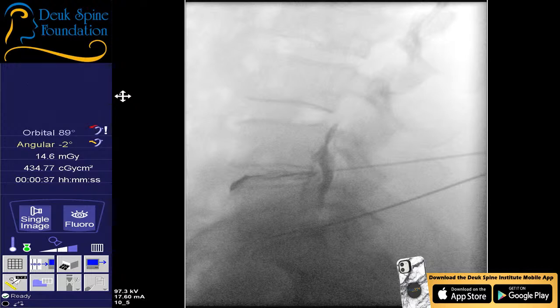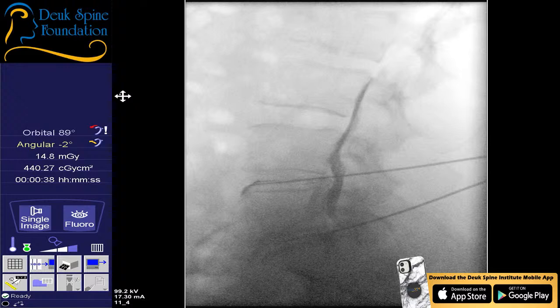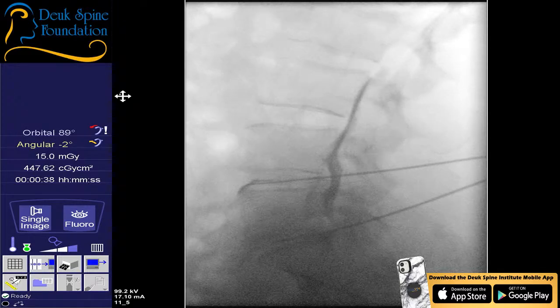Count out loud. So if you look at the second injection I did, the dye, you can see a large herniation there indenting the dye. You can see a massive disc herniation. That's a grade 5 annular tear and herniation. That's huge. That's at the L4-5. So even though the L4-5 is a huge herniation compared to L5-S1, the L4-5 is not as painful. Okay? So what do we learn here? The size of the herniation does not correlate with the amount of pain that a patient has from a herniated disc. Very, very important. They have nothing to do with each other.